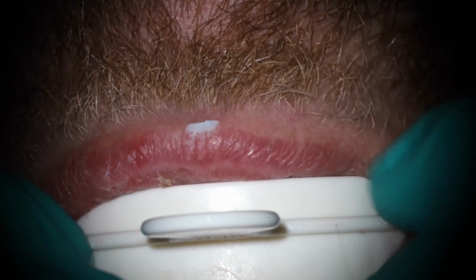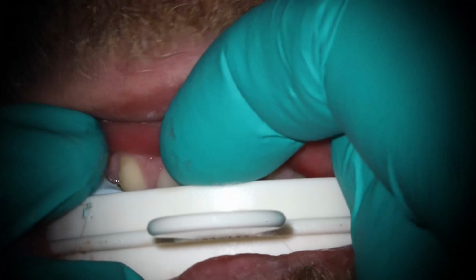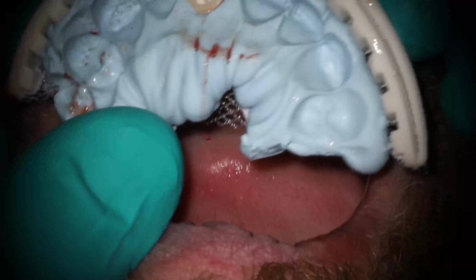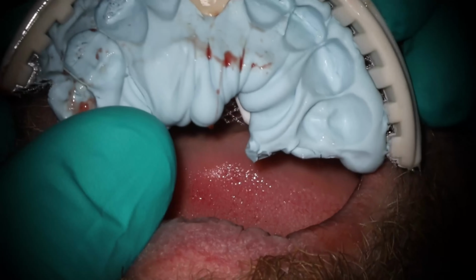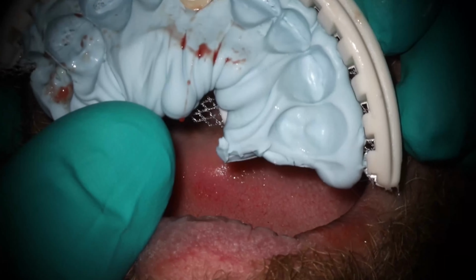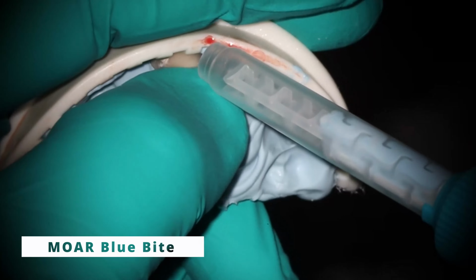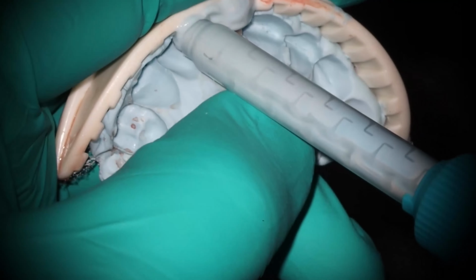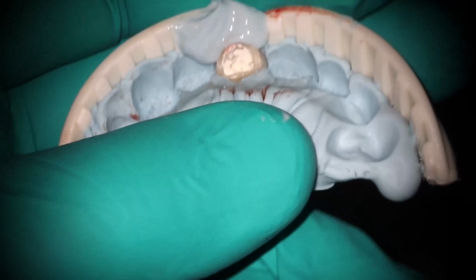A few moments later, here we go, and we're ready to pop this off. So as this comes off, you can see it's slightly undercontoured on the buccal there. And so I'm going to add just a little bit here in just one second. But what this allows you to do is give the general dentist a very good idea of what the tooth looked like beforehand and give the patient a tooth back. So you'll see here in a second how I do this.